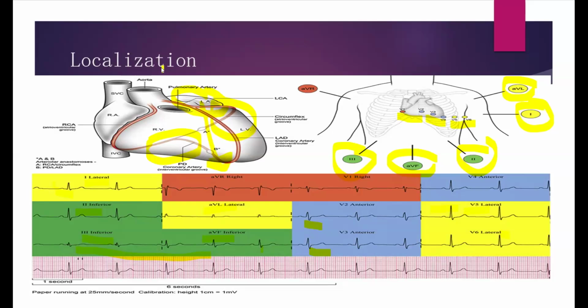Doctor, a follow-up on the same. Is the elevation different for the limb leads? You said for the anterior leads, or rather V1, V2, you have to have an elevation of about 1.5 to 2.5 millimeters. Does the same apply to the limb leads?